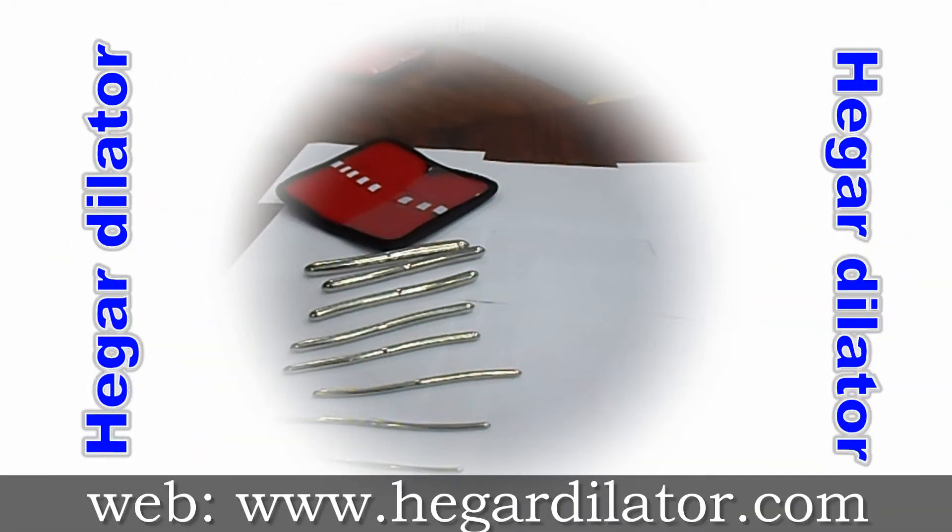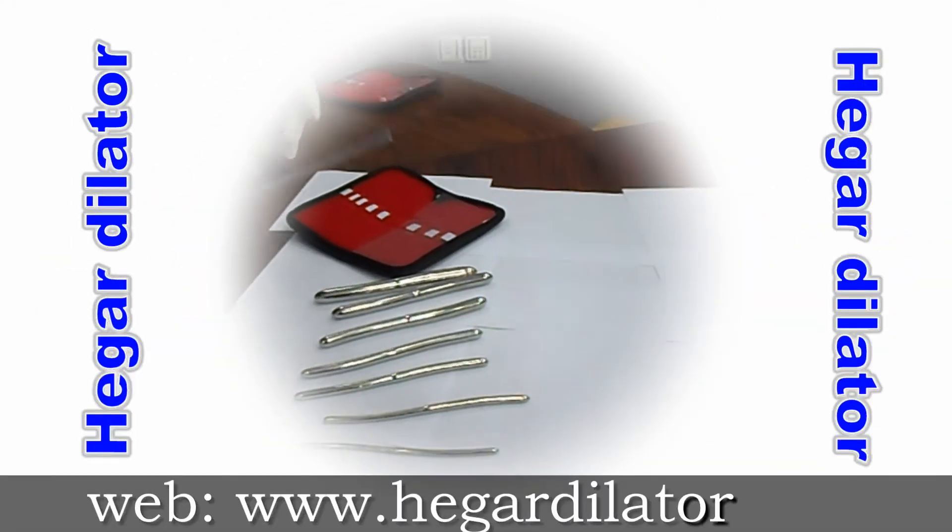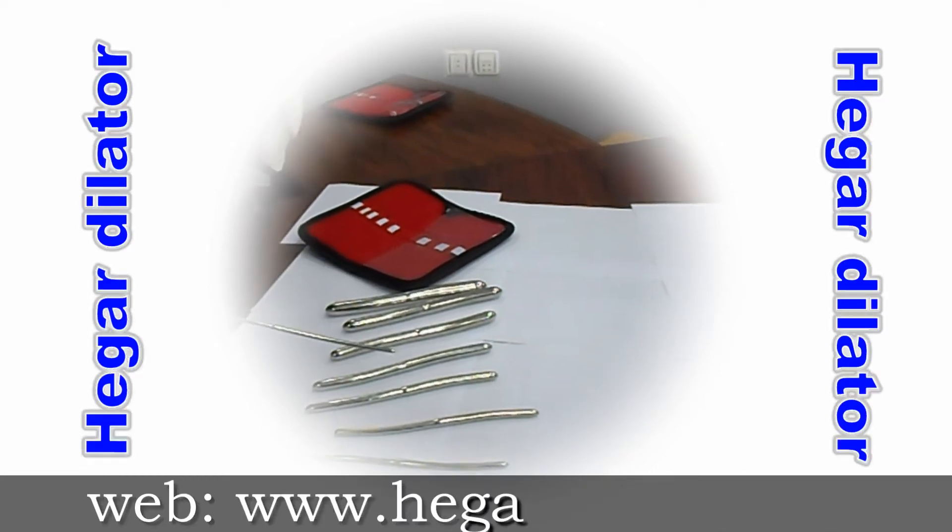Hello, hi, welcome to the Hamza store. This is the Hager U-Trendlater set, contains 8 pieces.